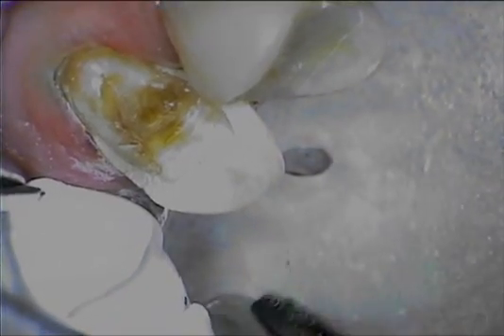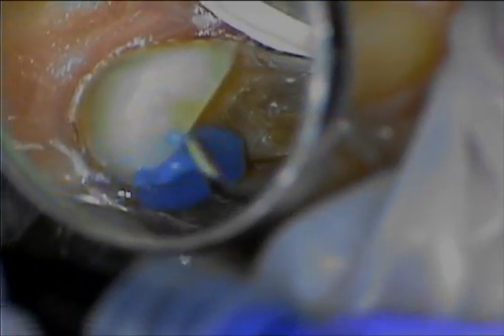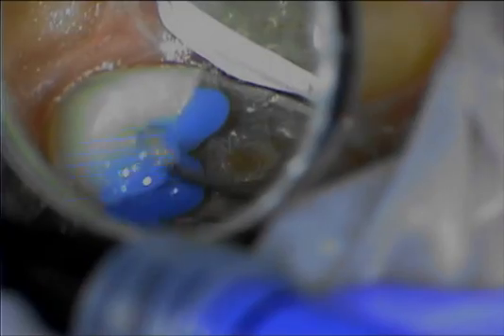After achieving adequate isolation using, in this case, an Isolite or potentially a rubber dam, and then applying Teflon plumber's tape to the adjacent teeth to minimize inadvertent bonding, we can prepare the teeth using whichever etching technique a clinician prefers.